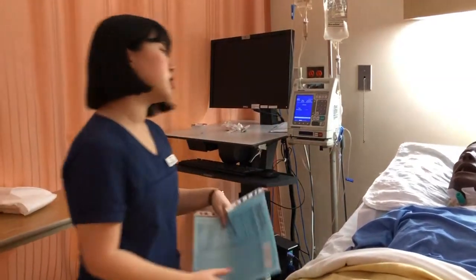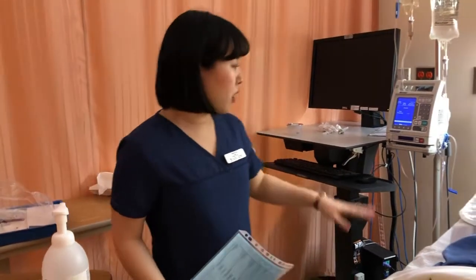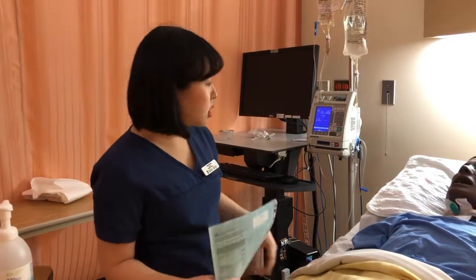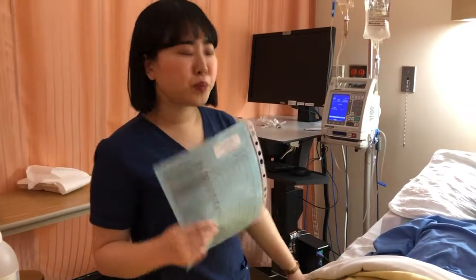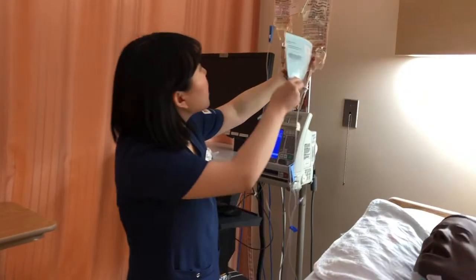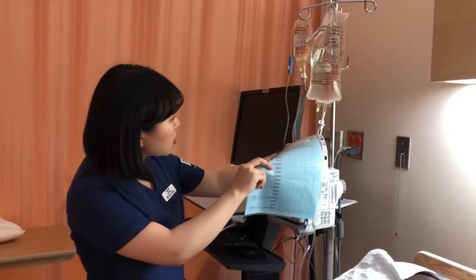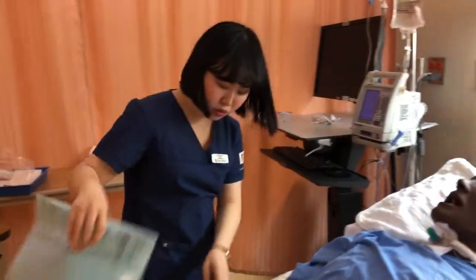So the patient has no visible distress, there are no visible hazards, and the call bell is within reach, and the patient is in semi-Fowler position. The bed rail is going to be put down for the video purpose. And I'm going to check the primary solution, which is normal saline, running at TKO. So I'm checking the drip. Okay, it's dripping, and I'm also checking the patient's IV site.